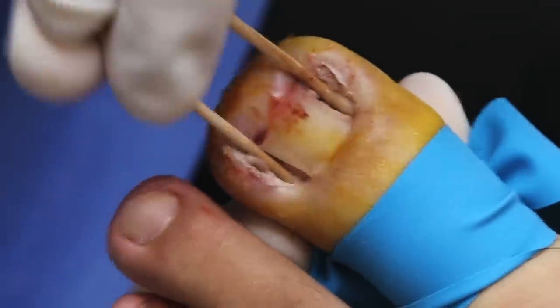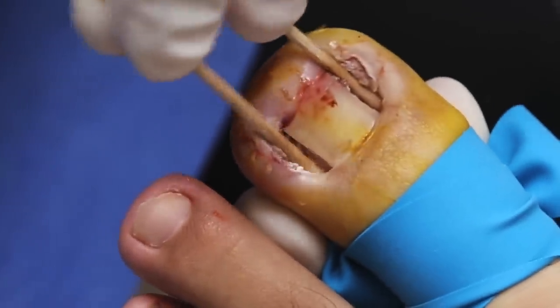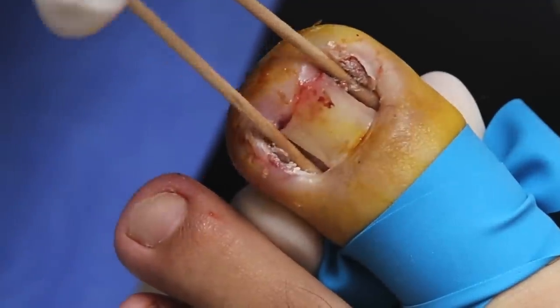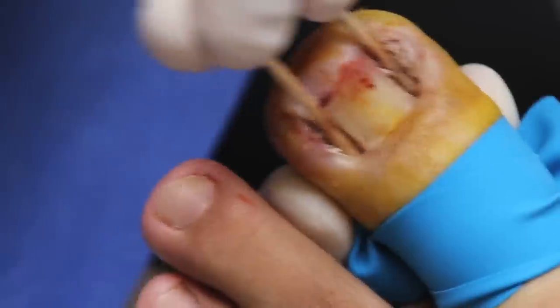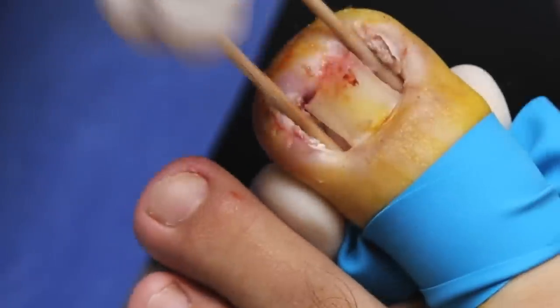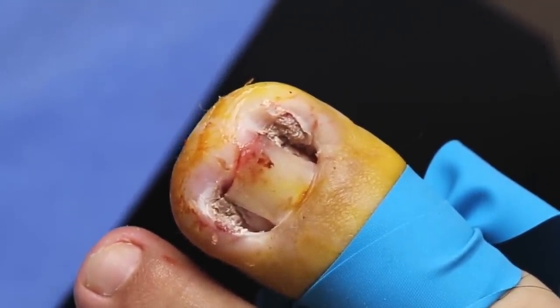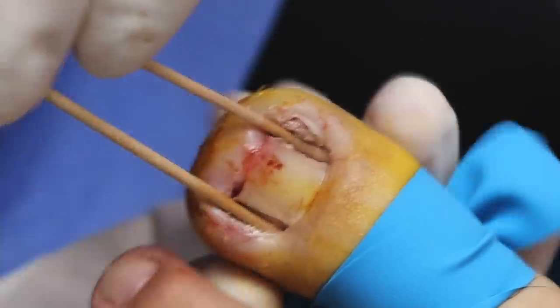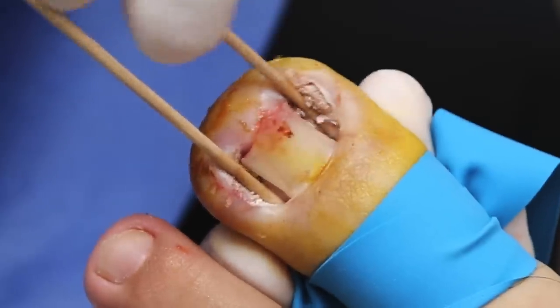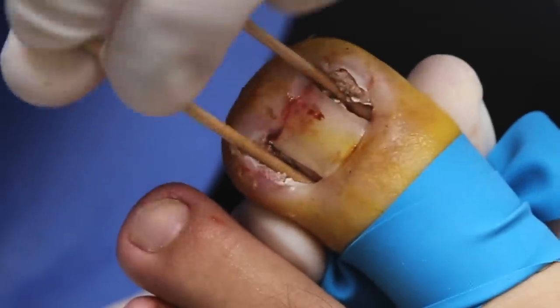No bleeding right now because we have the tourniquet on. When that comes off, it's gonna be bleeding. After the rubber comes off because I'm gonna be taking off the skin — every couple hours you're probably gonna have to change the bandage for the first day. I would sleep with a plastic bag on your foot tonight — put on a plastic bag and then put a sock on top so it holds the plastic bag in a nice shape. Do not be afraid, it's completely normal for the full 24 hours. Then the bleeding will stop and within one week the sides will look pretty flat. It'll heal very quickly. Take your antibiotics.